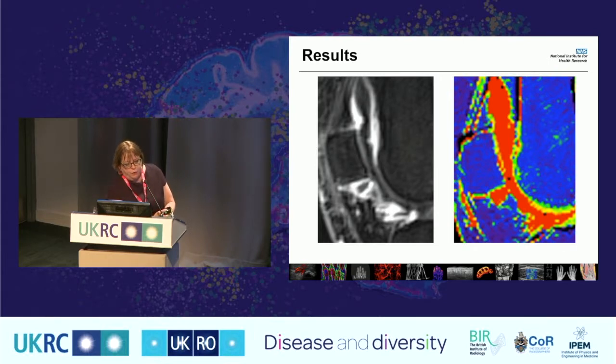And so we said this before, that we take for granted either you have this image of a T2 image where you put all the synovitis and the synovial fluid in together, and then we take for gold that the contrast image is what's really happening. But is it really? Because what we're doing is we're seeing either enhancement or we're seeing diffusion or perfusion of a fluid once you've had that injection.